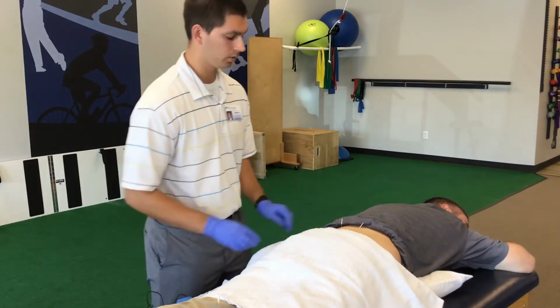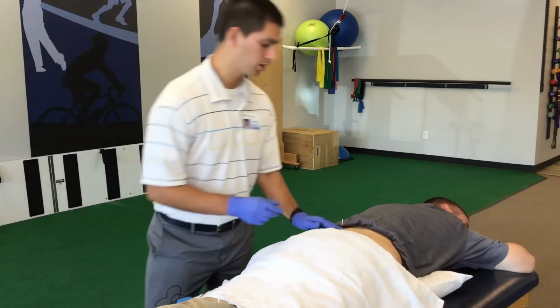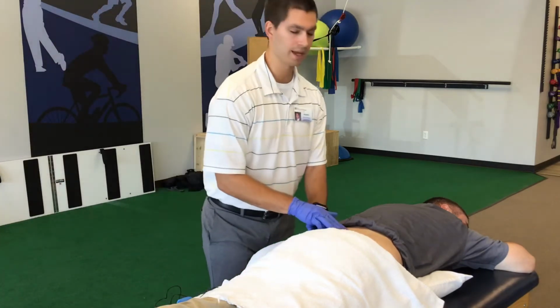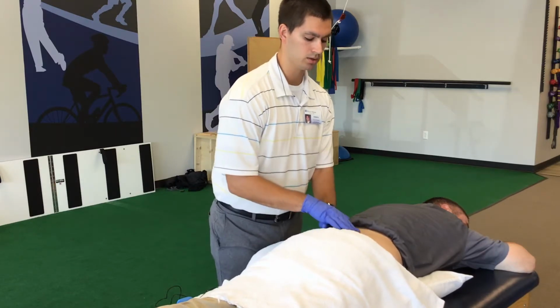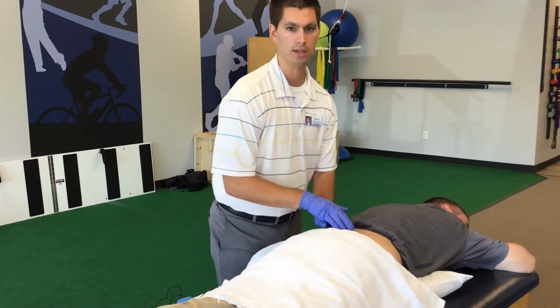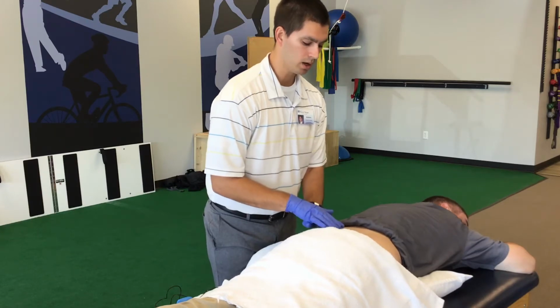If we were doing a thorough evaluation, we would do range of motion values. And so we would be able to see that Josh had increased range of motion of 15 degrees flexion and 10 degrees of extension, or he had less pain at the end ranges. And so we take the needles out here and just do some massage to try to decrease any soreness. If you just take the needles out and leave them on the table, the patient might have a little bit of soreness afterwards. It can be uncomfortable at times.